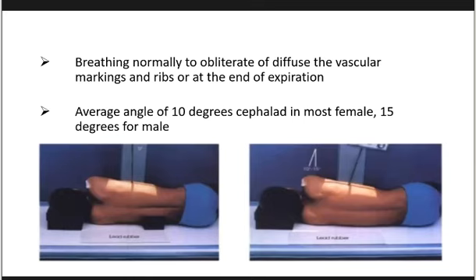If we x-ray the thoracic vertebrae, lateral, we have to put a lead rubber under the rib cage, here at the lower end of the ribs. If we have a lead rubber, the central ray is just perpendicular. But if we did not use lead rubber, this time we have to angle the tube cephalad. How many degrees? That is 10 to 15 degrees.